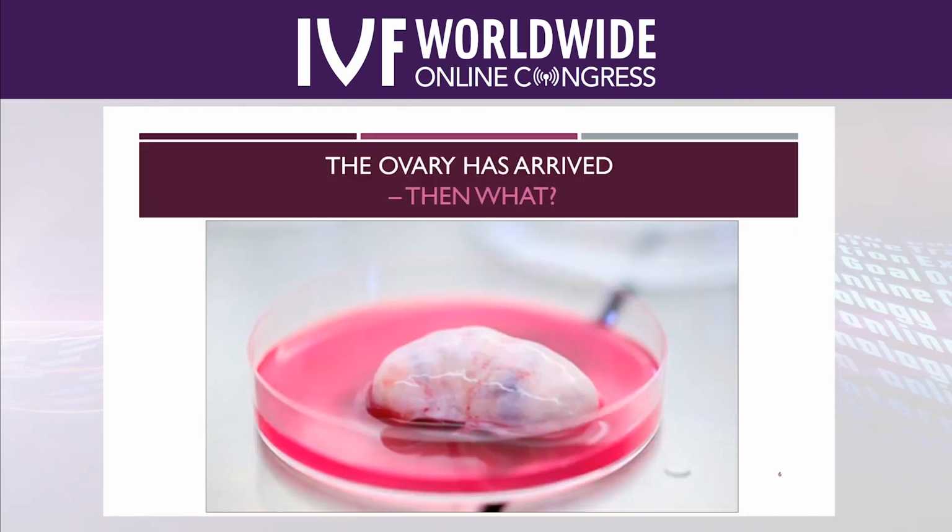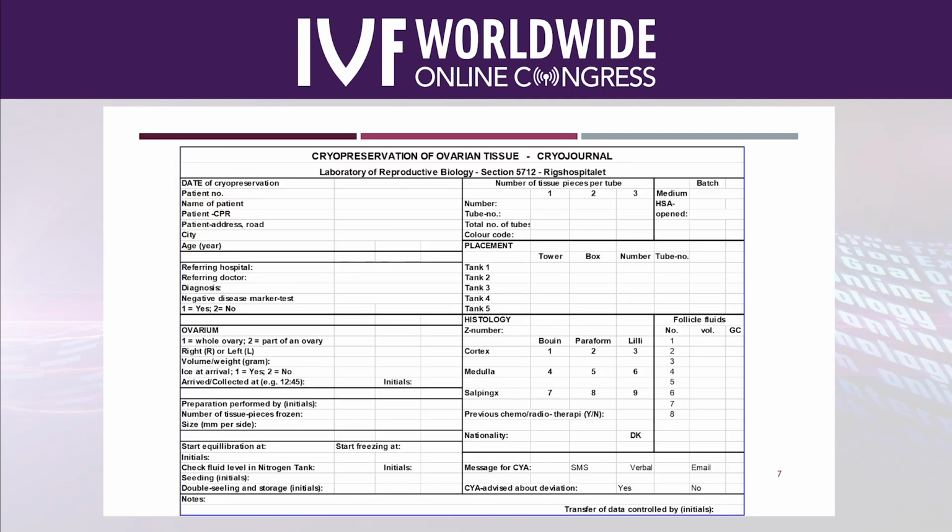So once the ovary has arrived, then what? Then we have this working scheme in which we can put in all the data. We put in the date, the patient number, the name of the patient, all the identification. We also put in the referring hospital and doctor, the diagnosis, and all the morphological characteristics of the ovary: whether we get a part of an ovary or a whole ovary, the volume, and whether or not there was ice on the transport once it arrived.